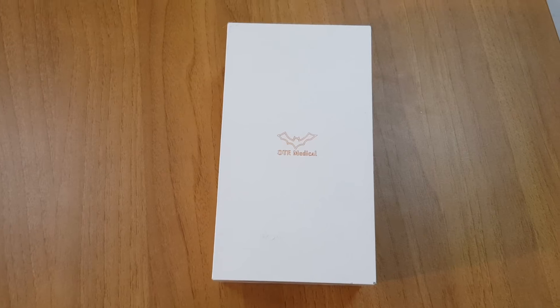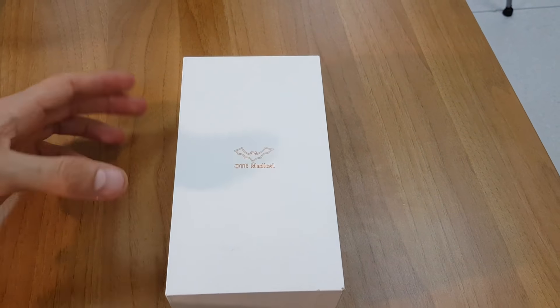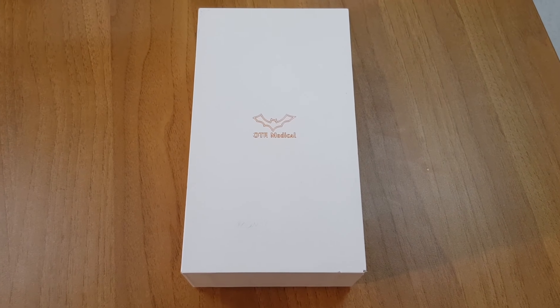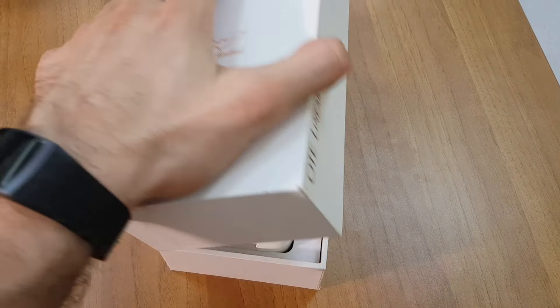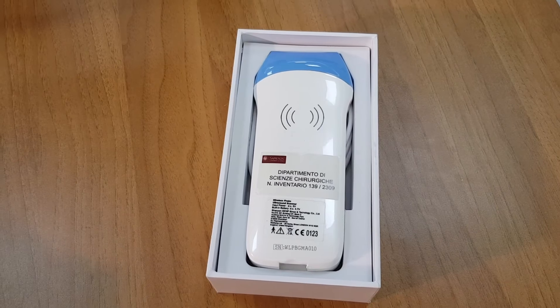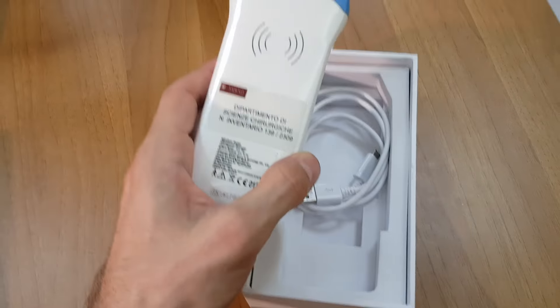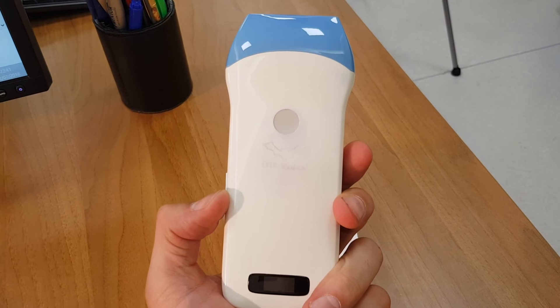Let's do the unboxing of the ecographic probe. As you can see, the box is quite spartan — there is only the logo of the product, the OTE Medical branding, and nothing else. Inside, there is our ecograph with the department label on it, since it is used not just by us but by everyone in the department.